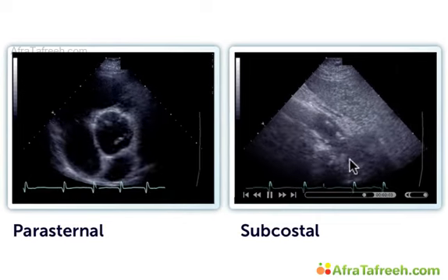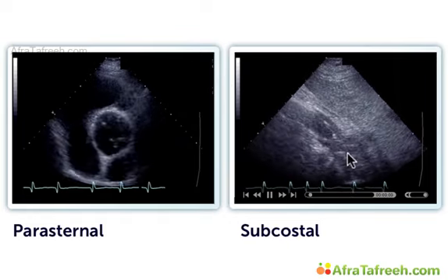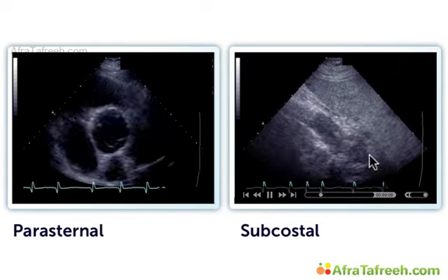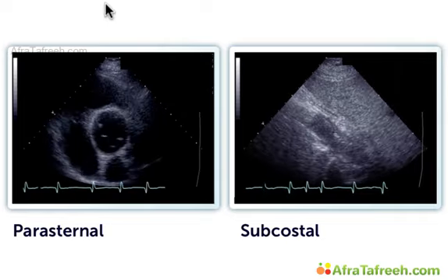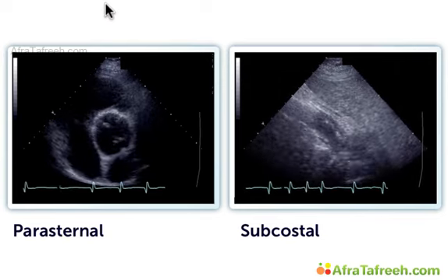And also, if we point the transducer in the same patient downwards and look at the descending aorta with the help of a subcostal view, we can also see that there's a dissection here. So we can assume that the dissection extends all the way down to the descending aorta. Therefore, it must be a type 1 or A dissection.